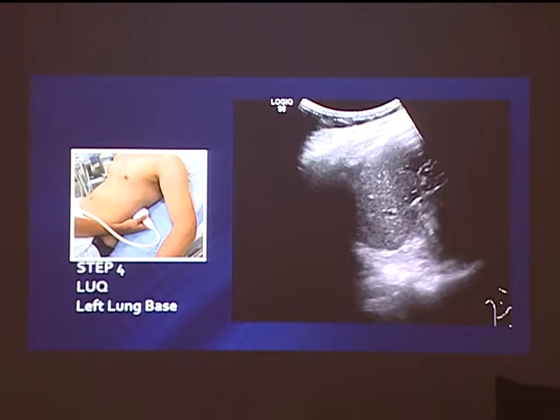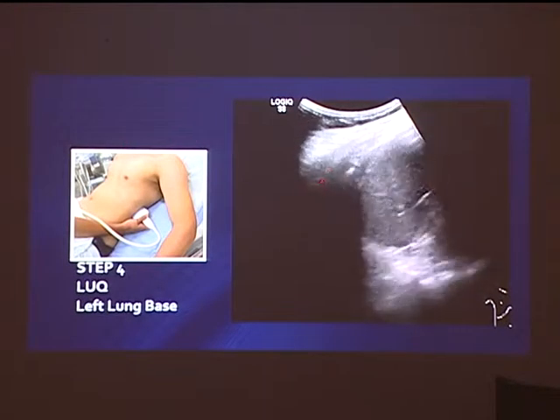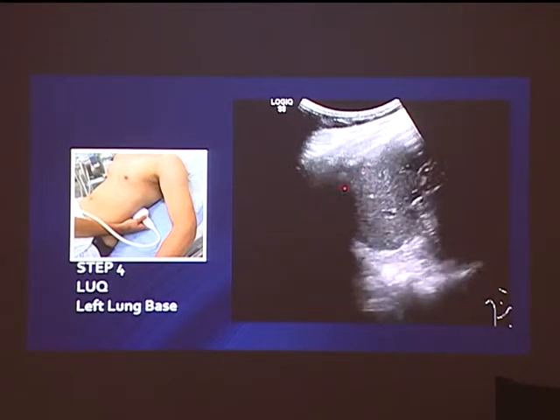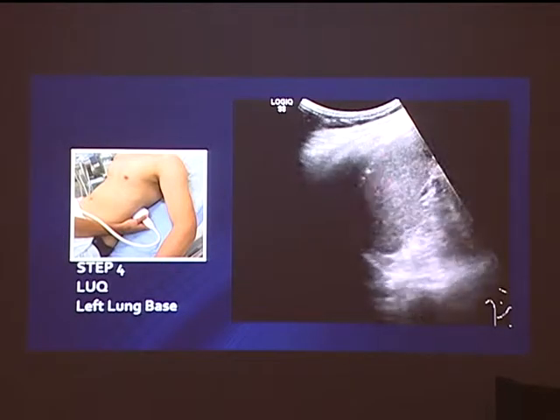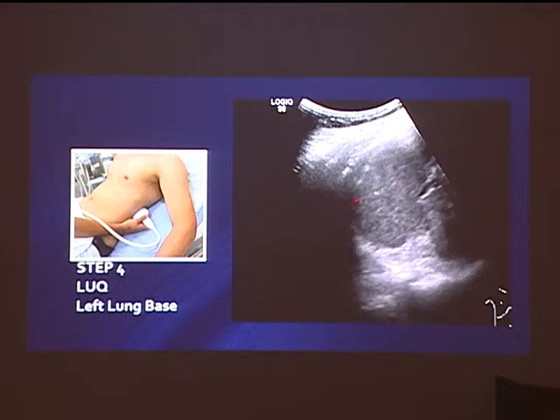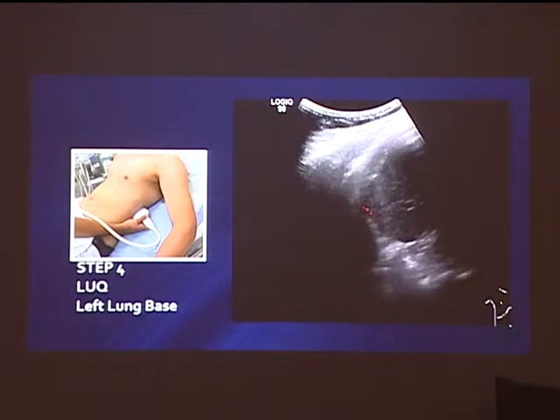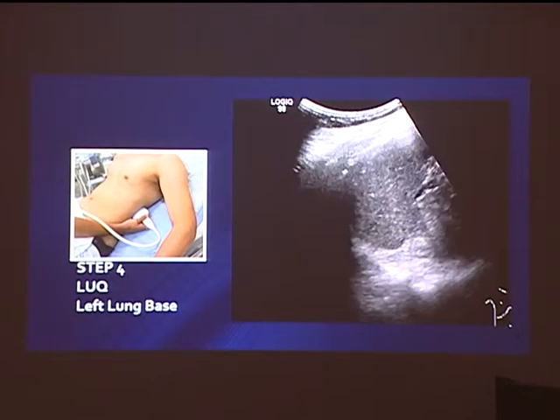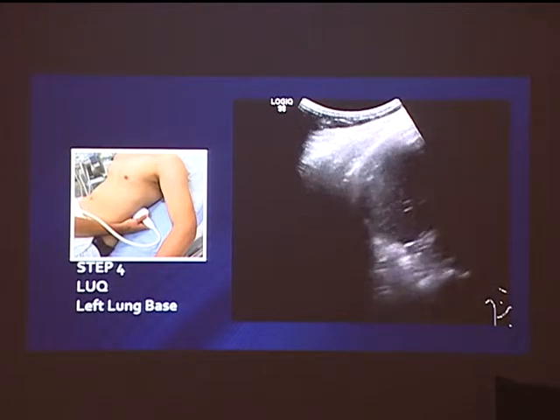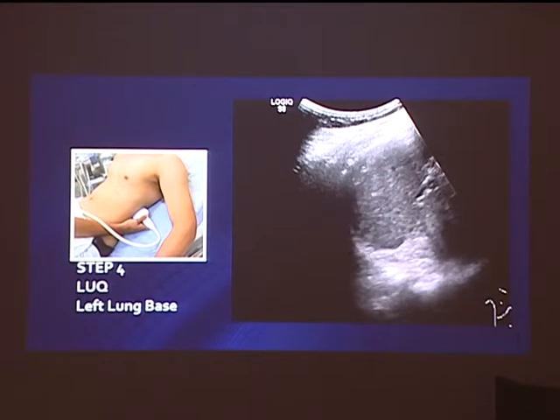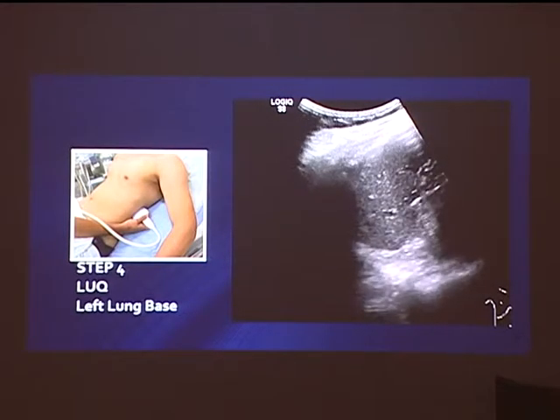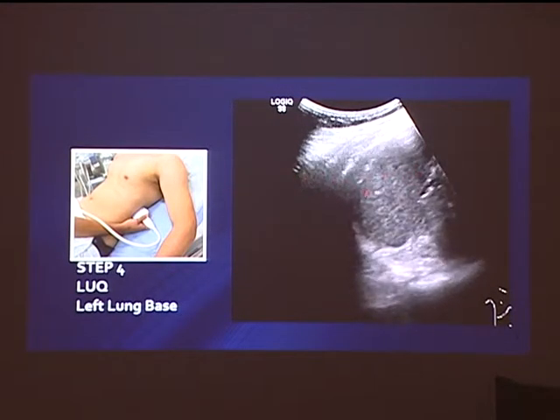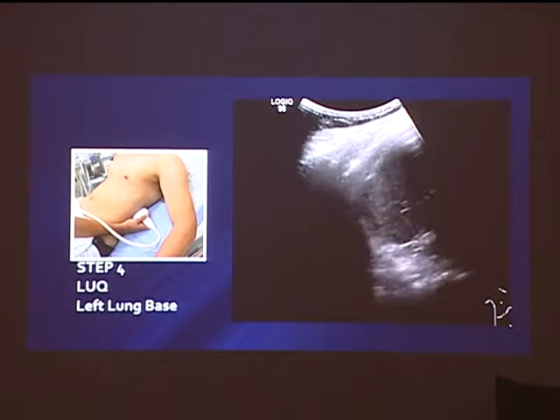Any problem with this one? You can see a little curtain sign — but this curtain sign shows the lung is expanded and touching the side. There's no fluid pushing it away, but something is wrong: the spleen seems to be separated a little distance from the diaphragm. There's actually a sub-diaphragmatic collection of fluid in this patient. In intra-abdominal trauma on the left side, because of the way the splenophrenic and splenogastric ligaments are oriented, fluid often flows to the sub-diaphragmatic space first before going to the splenorenal space. So don't forget to carefully look at this part of the left upper quadrant.